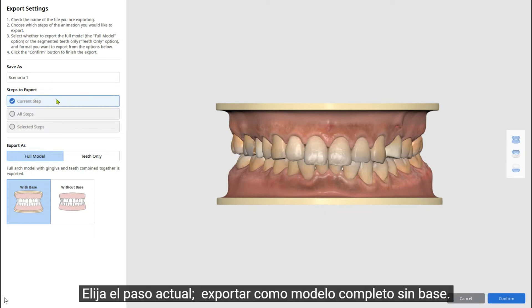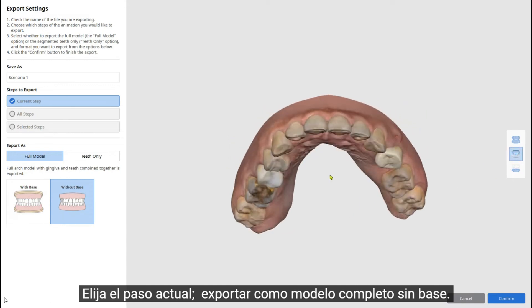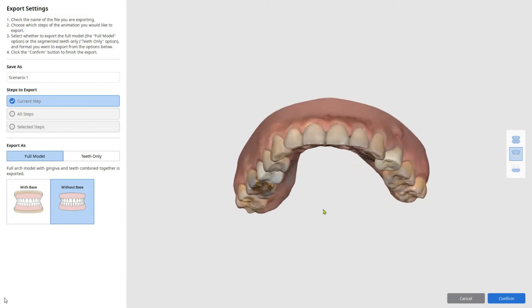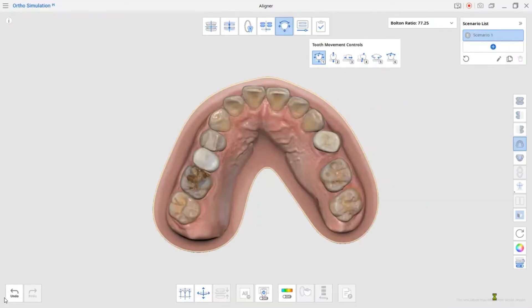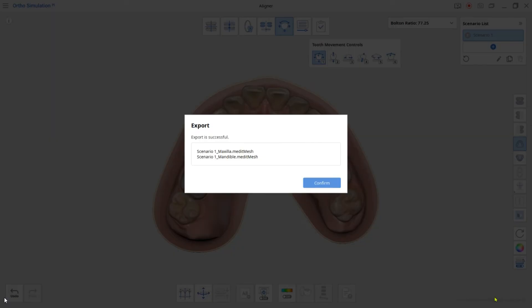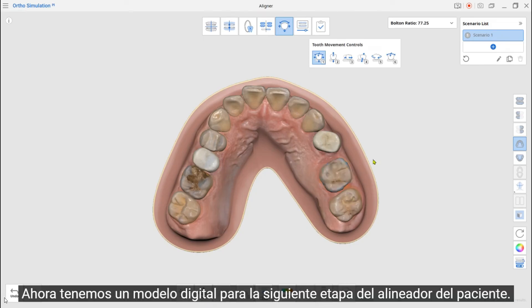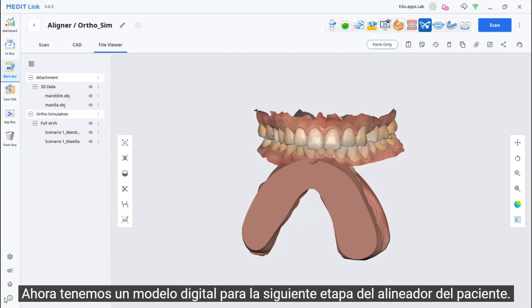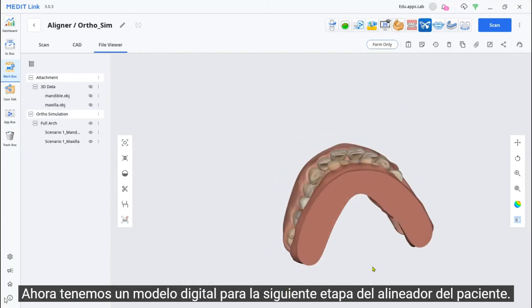Choose the current step and export as a full model without a base. Now we have a digital model for the next stage of the patient's aligner.